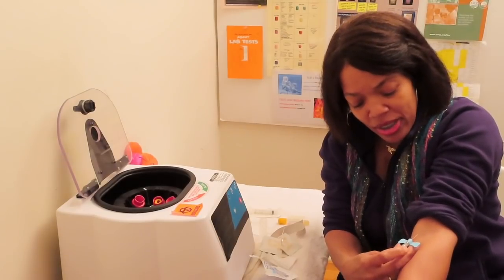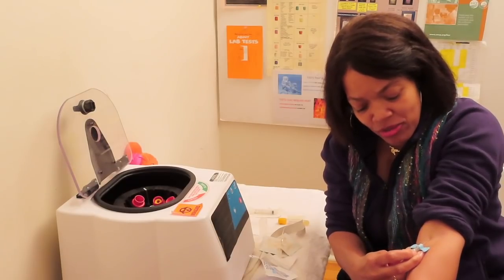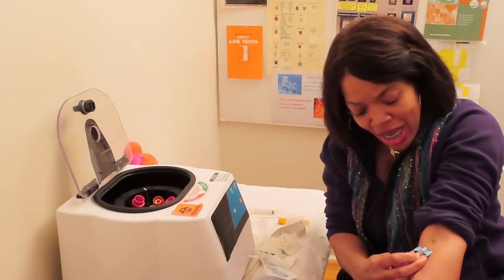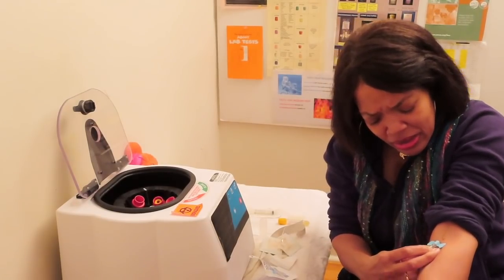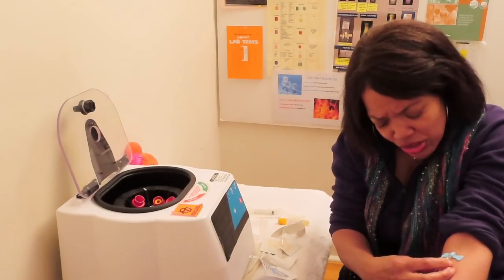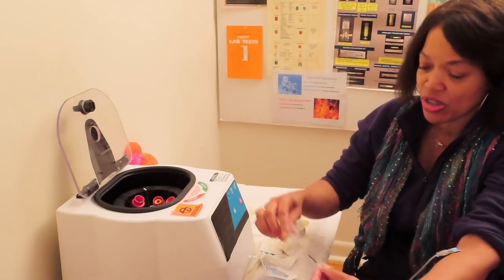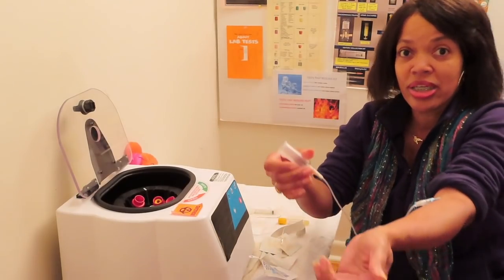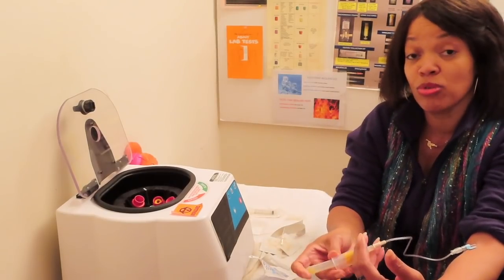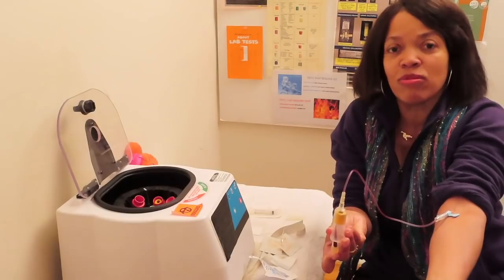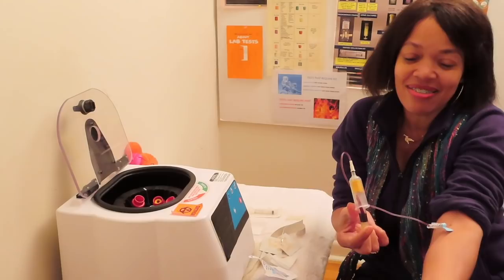And we're going to anchor. And we're going to anchor. And we are sticking at that nice angle that I've told you guys about and not nose diving. And we have a flash. Yes. So we have our flash. We have our hub that's attached to the bottom of the butterfly needle. We are going to insert our gold top tube because that's what we need. And we have blood flowing. You guys see it filling up? I know you see it.